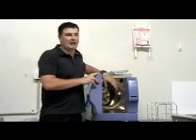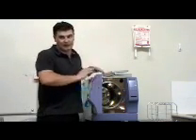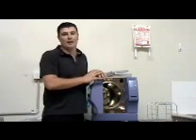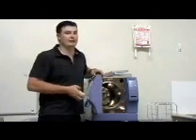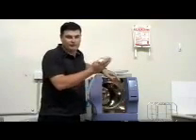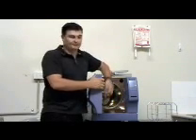If you do ever have something inside the chamber that won't remove with a little bit of elbow grease, before you try anything else, please contact Zone Medical. We will make a recommendation depending on what it is that has built up on the inside of your chamber. Okay? So again, with the lint-free cloth and distilled water, wipe down your chamber door and your door seal.